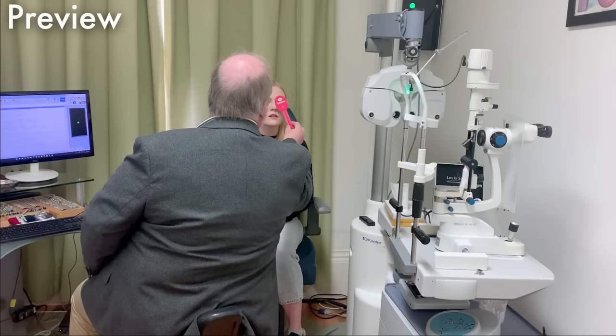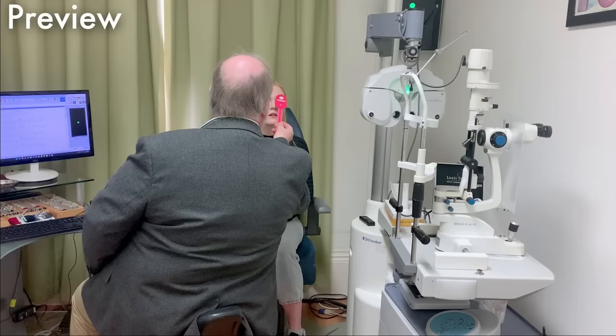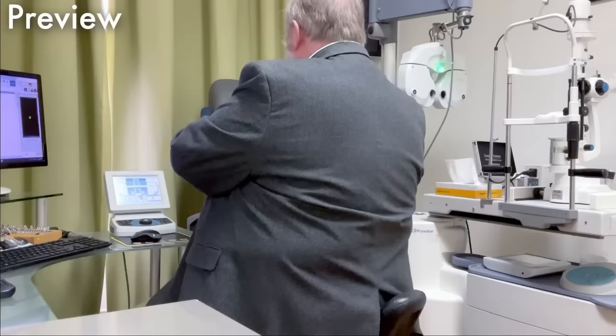Going to cover each eye, okay? And this might make the dot hop around a little bit. Does the dot hop or is it staying still? It moves. Is it going up and down or side to side? Side to side. Okay. Now I'm just going to take a measurement.